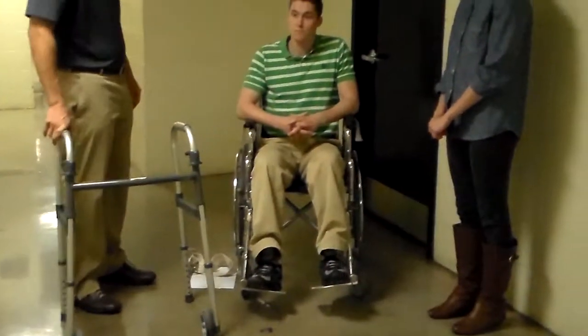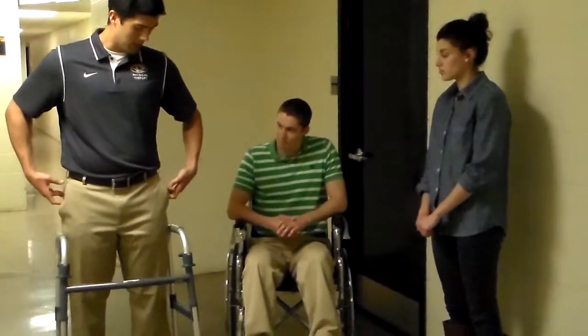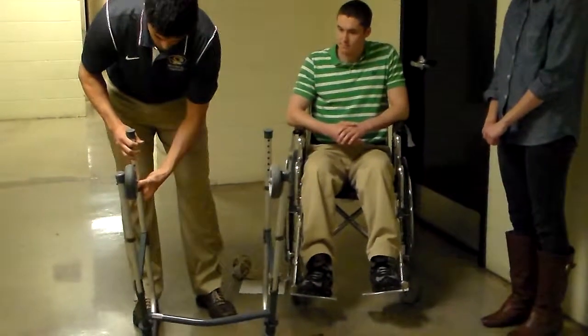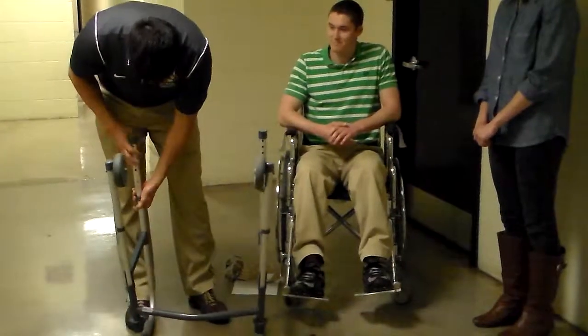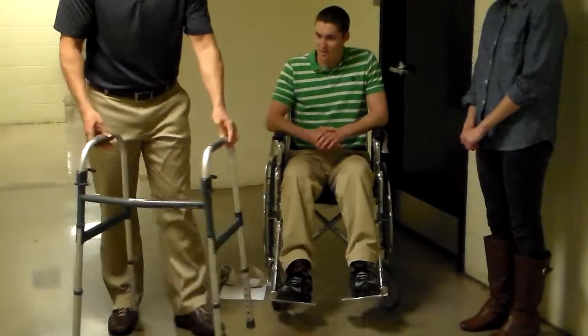So Pat, how tall would you say you are? Six foot. All right, six foot. I'm about six foot two, so I'm just going to place it a little bit lower than mine. Here's my greater trochanter. I'm going to adjust it accordingly based on the estimate — as tall as it gets.